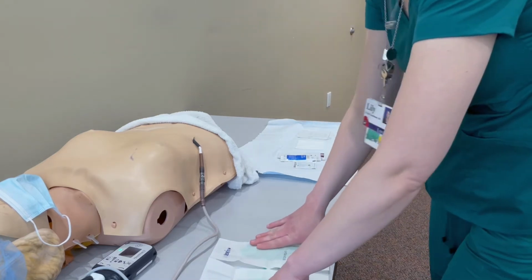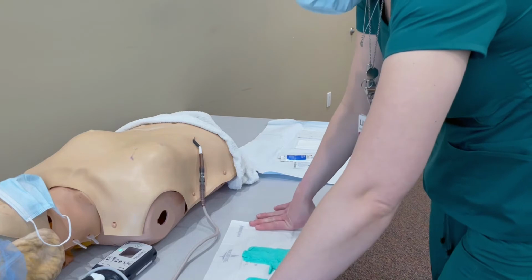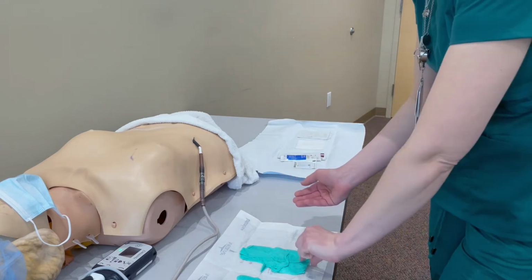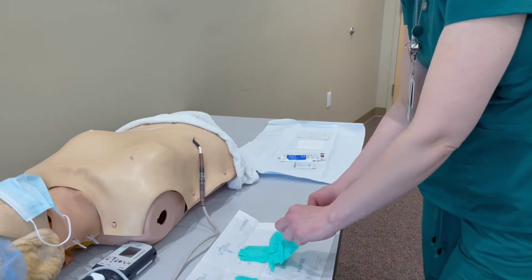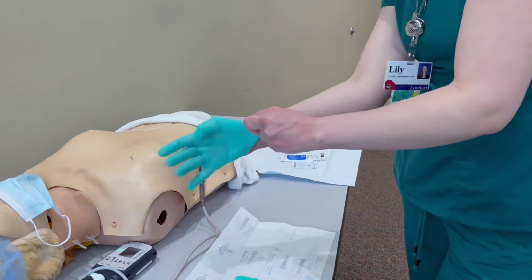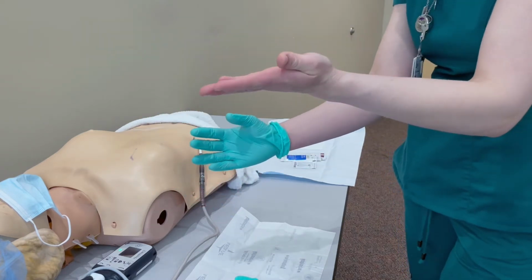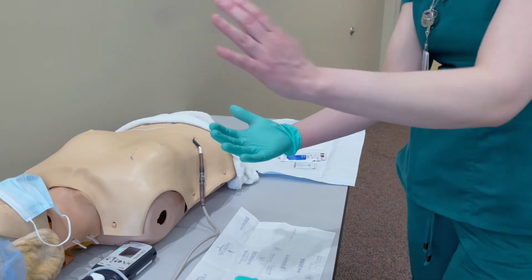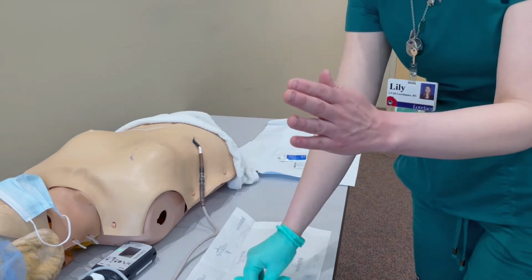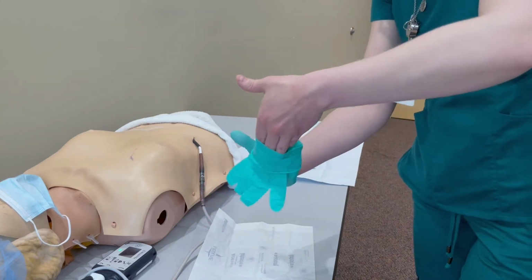So here, you're about to create your second sterile field. So you'll grab the edges of this and just open this up, getting yourself a nice surface area. You're going to use your left hand to reach and grab the inside of your right hand's gloves, pulling this over your hand and onto your fingers. If you get your fingers messed up, it's okay. I don't want you to reach and grab and touch them. Just leave them alone. We'll fix them after, because if you reach and grab this, that's breaking your sterility of your glove. Now you're going to use your right hand to reach inside of your left glove, creating a little pocket for you to slip your left hand into the glove.